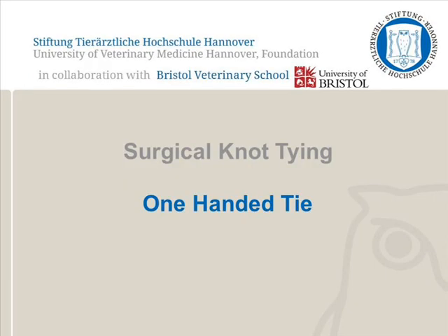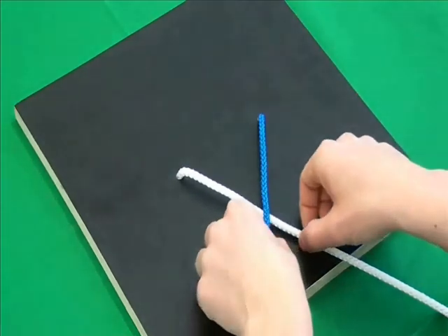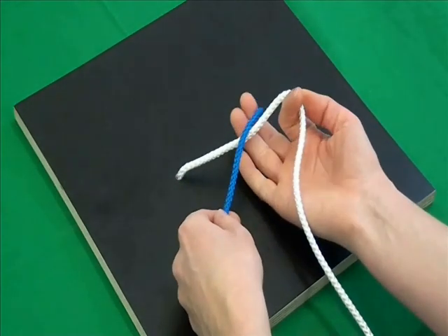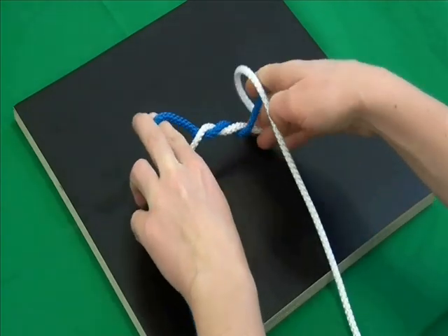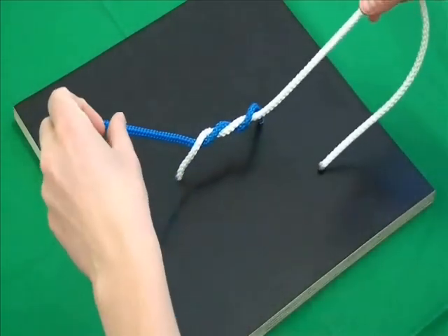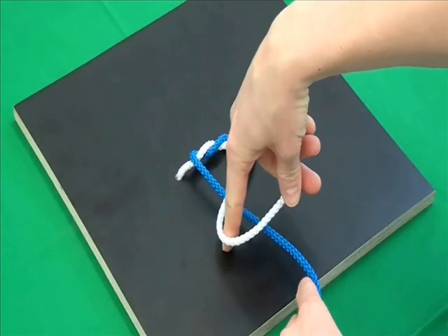In this video, a one-handed tie is demonstrated. When performing a one-handed tie, one hand holds the thread while the other hand ties the knot. The one-handed tie has the advantages that it can be completed fast without visualising the knot and in a restricted space.